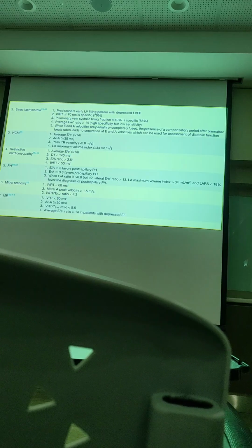So these are the other parameters which are helpful for patients with other comorbids, the ones that are not so reliable. Kalau perasan in the ASE algorithm first, they dah mention at the top right which kind of patient you cannot use the algorithm. So those are the ones penting you know that these are the parameters you use for those kind of patients. You tak boleh guna the biasa punya algorithm. Okay.